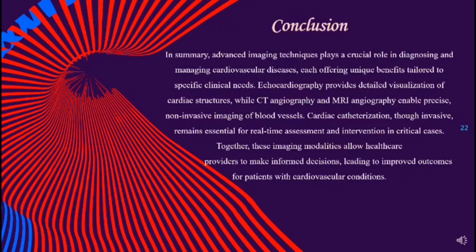In summary, advanced imaging techniques play a crucial role in diagnosing and managing cardiovascular diseases, each offering unique benefits tailored to specific clinical needs. Echocardiography provides detailed visualization of cardiac structures, while CT angiography and MRI angiography enable precise, non-invasive imaging of blood vessels.